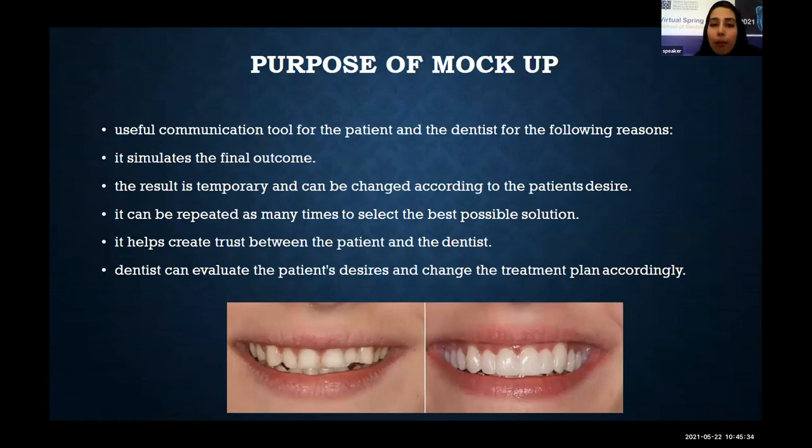Mock-up has some purposes. First, it's a useful communication tool for the patient and dentist, and it simulates the final outcome. The result is temporary and can be changed according to the patient's desire, and it can be repeated as many times as needed to select the best possible solution. It helps create trust between patient and the dentist, and dentists can evaluate the patient's desires and change the treatment plan according to it.